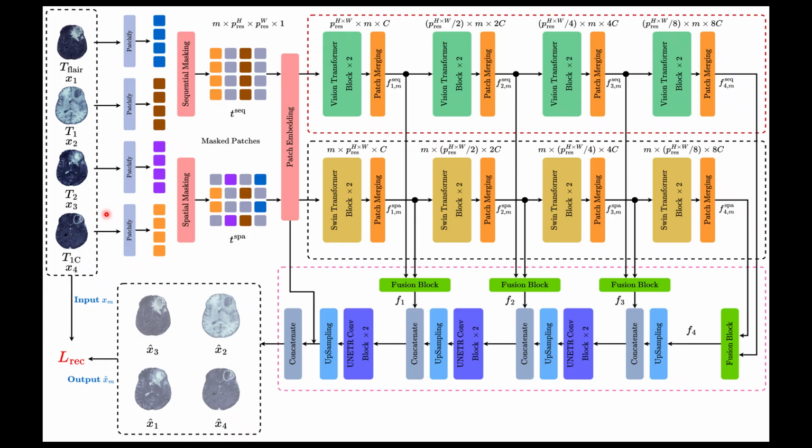Brain tumor diagnosis typically relies on 4 MRI modalities: T1, contrast enhanced T1, T2 and FLAIR. Each one highlights different tissue. Miss one and your segmentation accuracy can drop from 82% Dice all the way down to 45%. The challenge isn't just filling the gaps. You need a single unified model that handles any combination of missing modalities, not a separate model trained for every possible input-output pair, which would explode combinatorially.